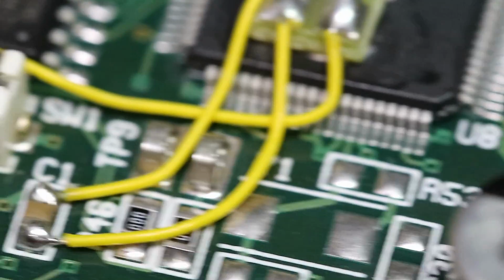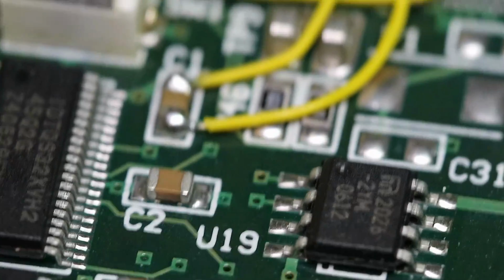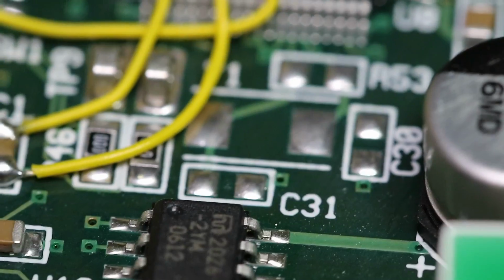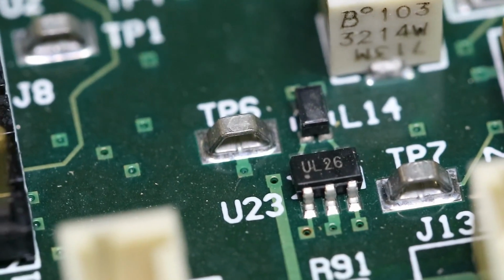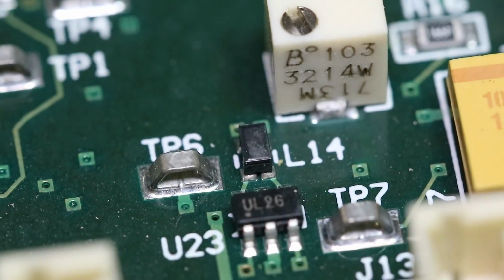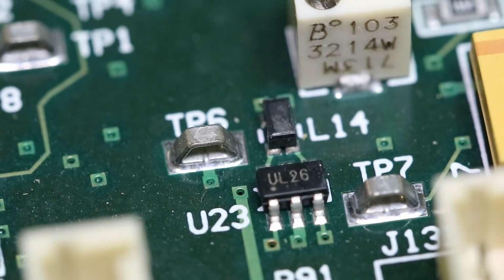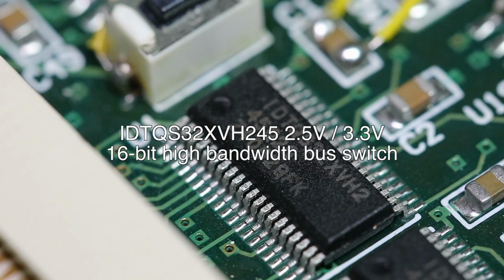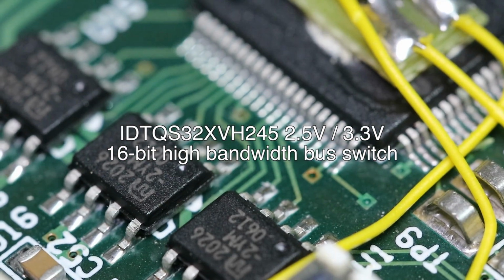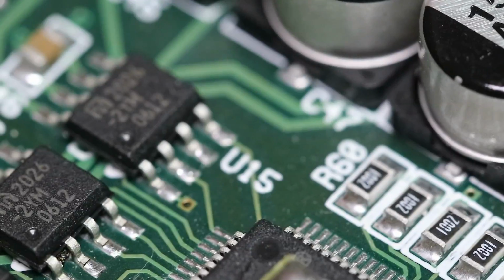There's also some test points down here, TP9, and I assume the other's 10 or 8. And there's some missing components on here, a couple tantalums, and what looks like more test points. What looks like a little regulator, probably a really tiny switching regulator. There's an inductor there, but that could just be a ferrite bead or something. I don't know. And we've just got some IDT parts, probably bus drivers or something. Can't be bothered to look those up. And that's pretty much it. There's not too much on this board. It's really just a fancy USB 2 hub.